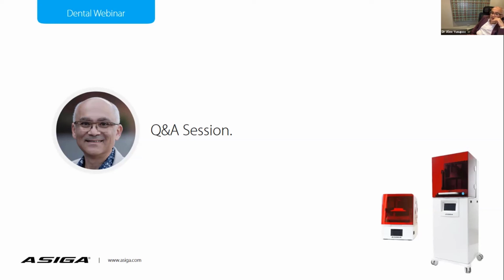The other thing is, Graham, I think I'm right, but I think the little machine is actually a little bit more capable. It can print, or does the big machine do the same? Because some materials are actually designed for the smaller machine. So how do you mean from the compatibility with materials? For the restorative stuff, are they both equipotential or some materials they are? So I was wrong about that. I think it's basically just saving the volume of material and being able to use multiple materials without having to buy liters of the stuff to fill a big tank.